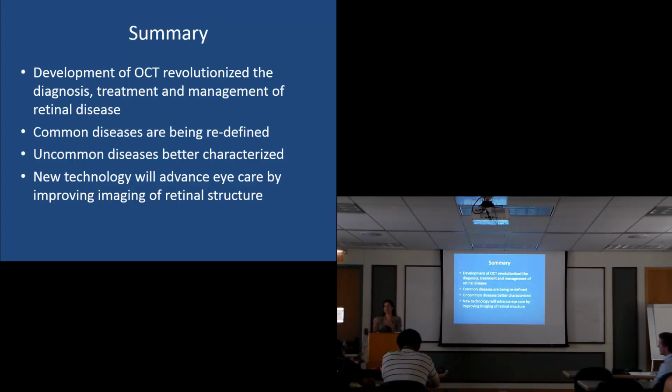My research was looking at, if you look at a clinical study of treating macular degeneration, they use central subfield thickness and a drop in visual acuity of 5 letters, and that's not picking up the earliest disease. So probably patients aren't doing well because the clinicians are not sophisticated enough to read the OCT image. Now that's changed. In the last study we did on AMD, they did have reading centers interpret the images, and that really improved outcomes in patients. So we do realize that the average person treating AMD is not sophisticated in reading the OCT. When you have a reading center, treatments are better, outcomes are better.